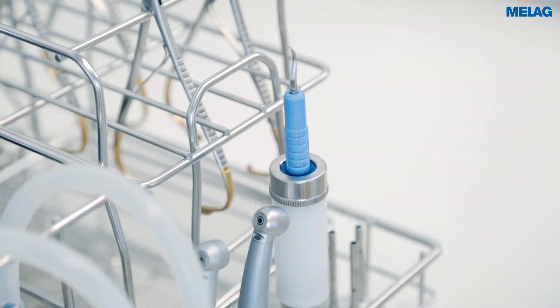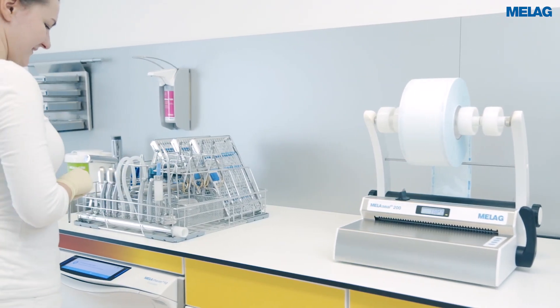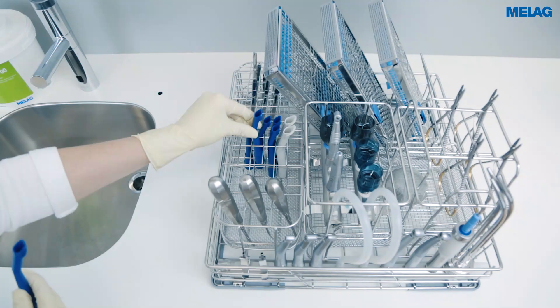Cavitron ultrasonic scaling inserts can be reprocessed using the rinse sleeve. The narrow inner diameter of surgical suction cannulas means that they should be placed on an injector nozzle. Where necessary, the number of injector nozzles can be increased through the use of a triple distributor.